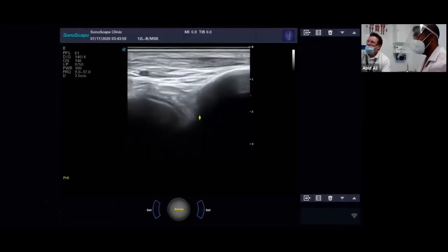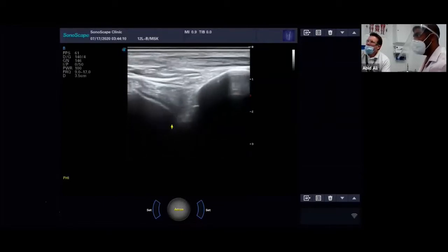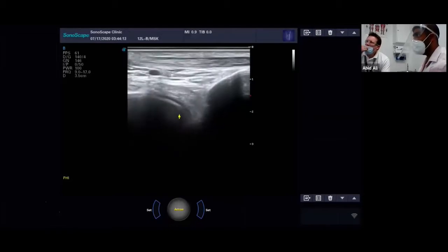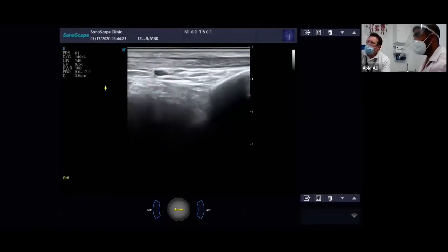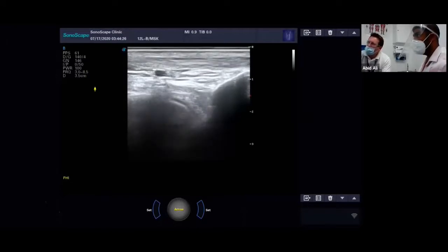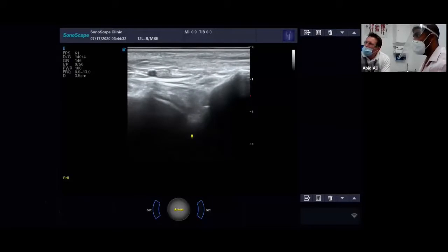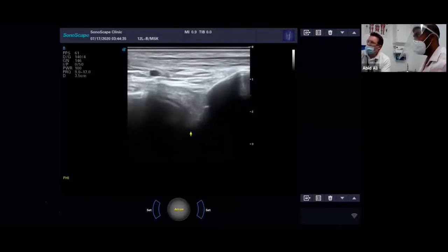Yeah, nice. Okay, so that's kind of the picture you're looking for. So you've got the end of the tibia, which Adrian's just marking out, and the top of the head of the talus, and we've got this nice V shape in the middle. And you can see the extensor tendon along the top. So that's a nice textbook image. Should we freeze there? If you are struggling to get down deeper, don't forget you can always alter your frequency. Go down your frequency, and you see how that's lightening up down here? It just gives you a bit more penetrative power. But we're getting down fine, so I'll take that back up. Sorry, Abby, you want to freeze that? Yeah, freeze that there, I think.